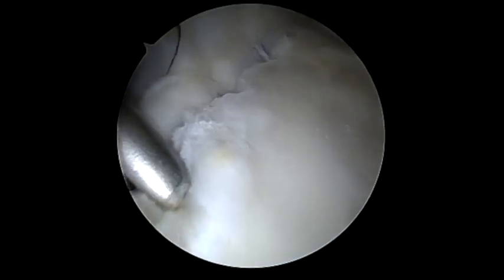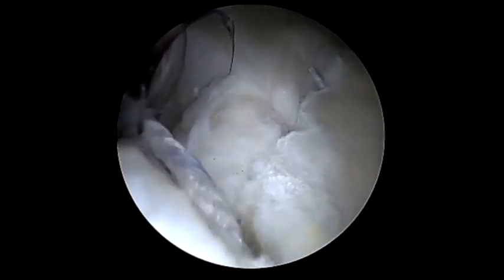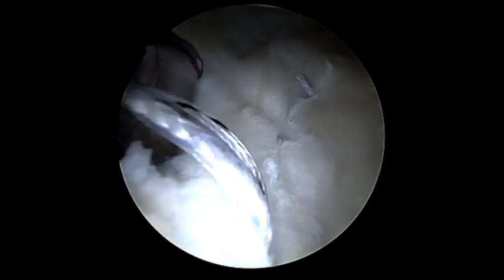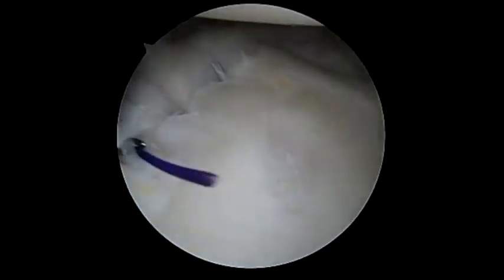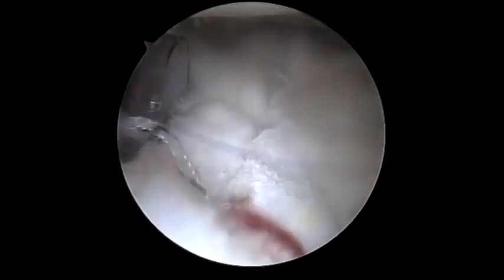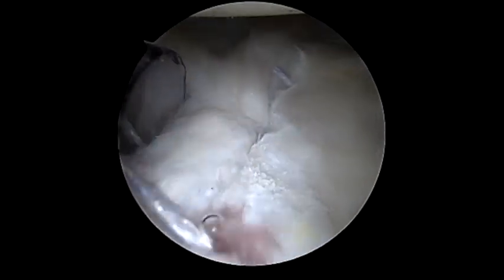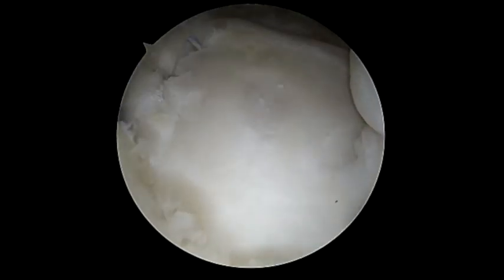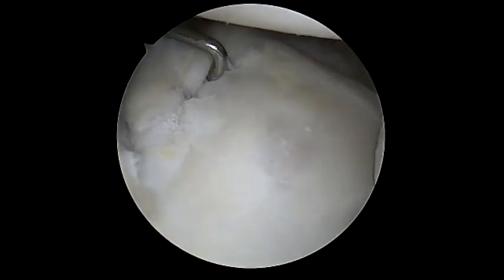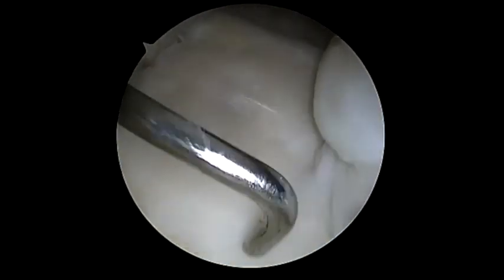You can see we have excellent fixation already. We place one more anchor using the curved guide, then use a crescent for grabbing and passing the suture, and then engage the locking function. You can see the sequential tightening of the capsule and labrum and the low-profile nature of this repair, and we've seen excellent results in our players.